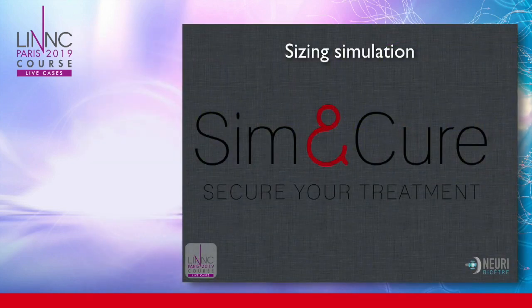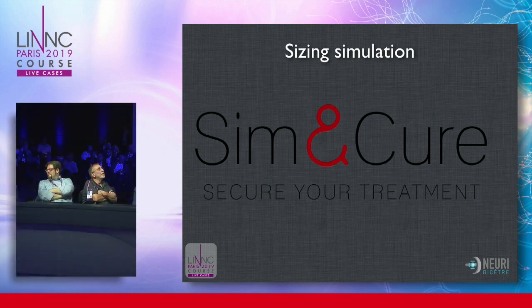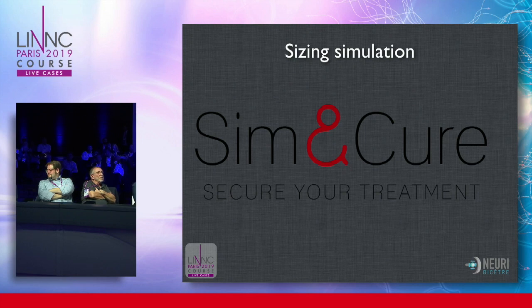The big concern with the flow study when you put a flow diverter is that 98% of the cases are cured whatever you do. So it's pretty much trying to depict the 2% of cases that are not going to work. It's not too much of a big deal. If it doesn't work after the first one, you deliver another one 3 months later or 5, 6 months later, and that's it. So I totally agree.